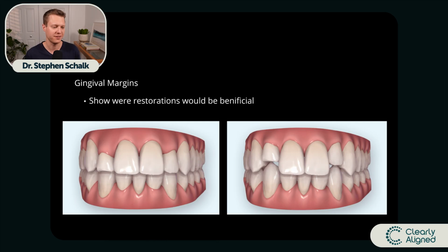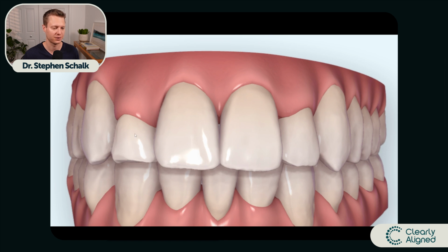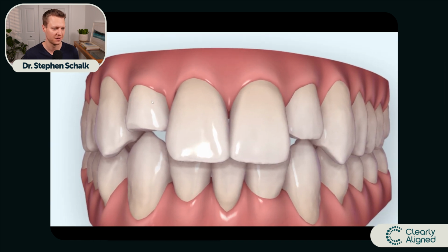The other thing that's really valuable from the outcome simulator is that we can actually go ahead and move the teeth to show the patient where the gum lines should ideally be. So again, look at the difference in height between our 1 lateral incisor and then the one on the other side. You can see how different they are. And if we actually put them where they're supposed to be, then you can see how much tooth structure has actually been ground off of those teeth. And so that allowed us to have a conversation, not just about the orthodontics, but also about restoring things at the end of the day.